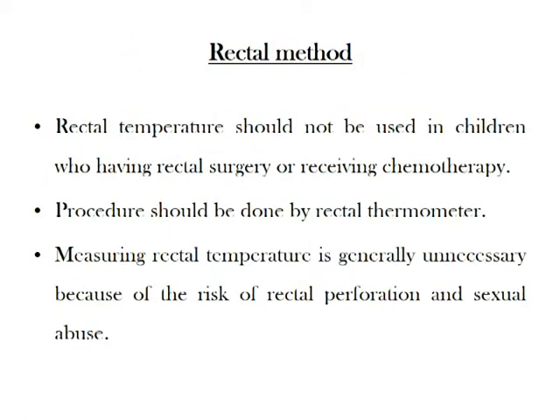Rectal method: rectal temperature shouldn't be used in children having rectal surgery or receiving chemotherapy. The procedure should be done with a rectal thermometer. Measuring rectal temperature is generally unnecessary because of the risk of rectal perforation and sexual abuse.